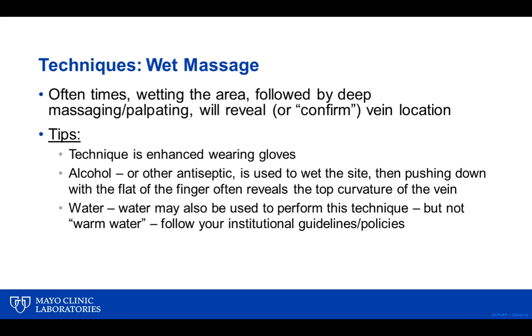And you can actually wet the area, and then by pushing down gently with your finger and moving it back and forth, you can actually feel the top curvature of the vein. You can feel the roundness, you can feel the softness, and that will help you be more confident in the fact that what you are feeling is truly a vein.